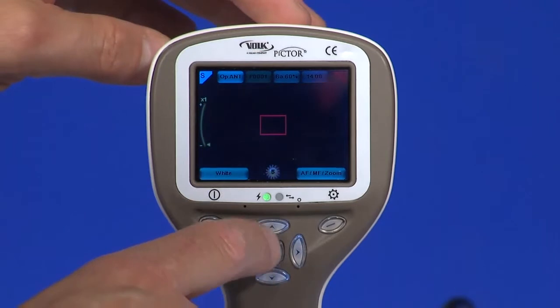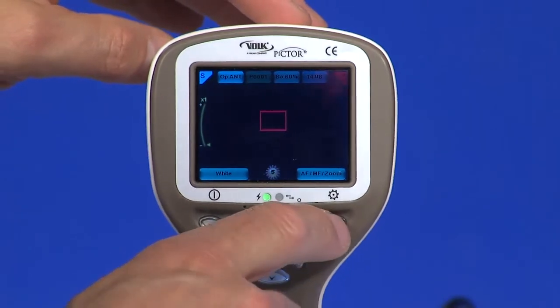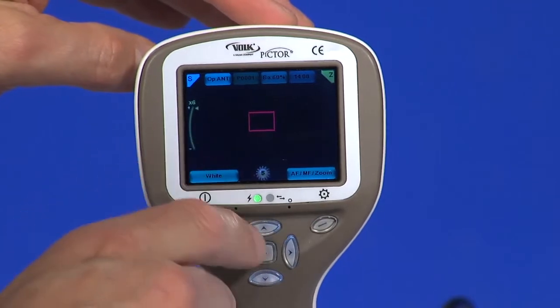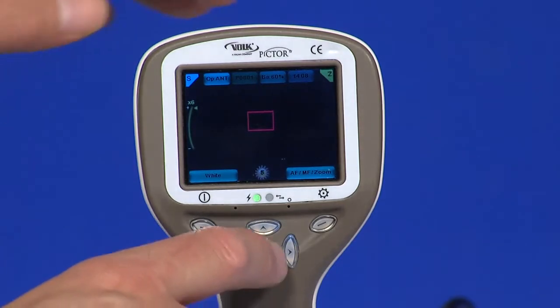Use the up and down arrows to focus manually. Zoom in using the arrow key up, and zoom out using the arrow key down. There are four zoom levels: 1, 2, 4, and 6. Move the focus window left and right after pressing the middle key to activate.